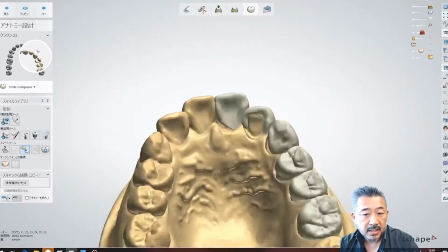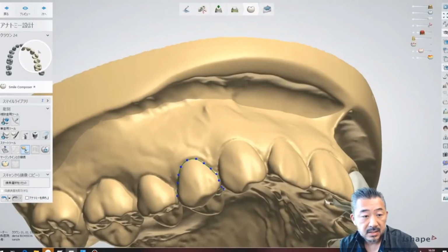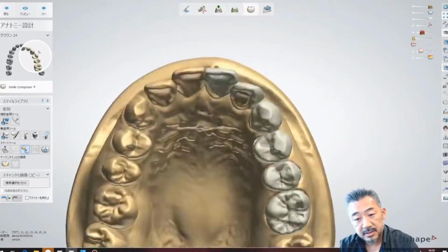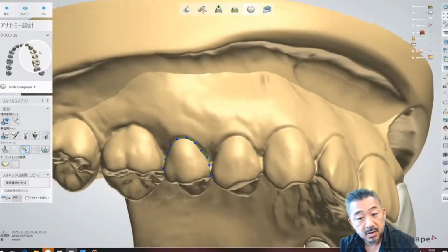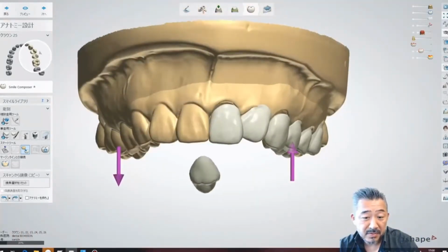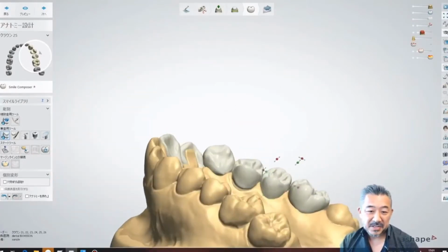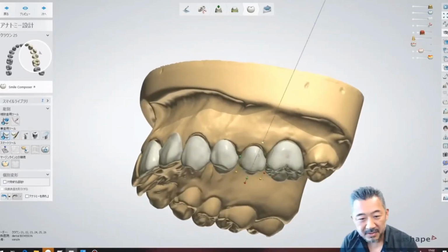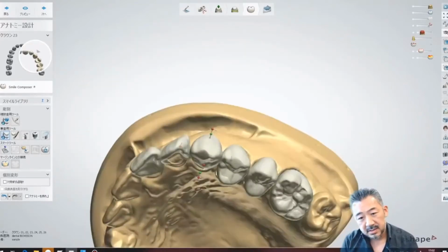The margin line and the alignment may need to be adjusted. So adjust the crown length according to the margin line. The shape is mirrored, so adjustment is made very easy. Even if you mirror it, no one in the world is perfectly symmetrical, right? That's why I need to adjust the arrangement and the size of the crown. At this point, margin lines are not connected yet.